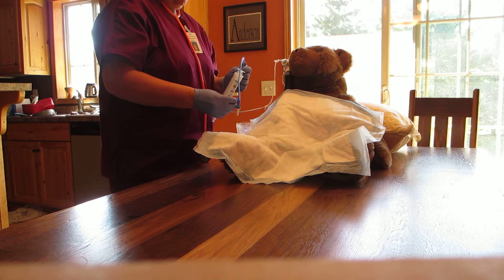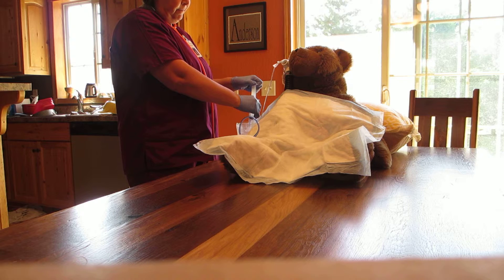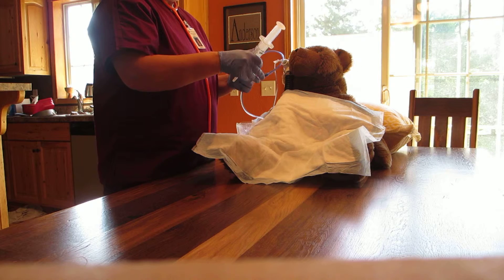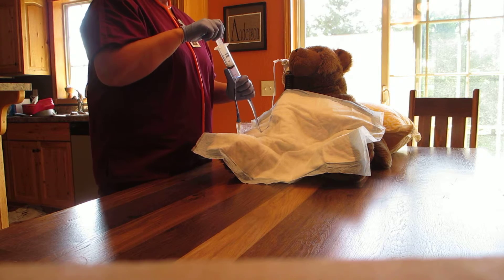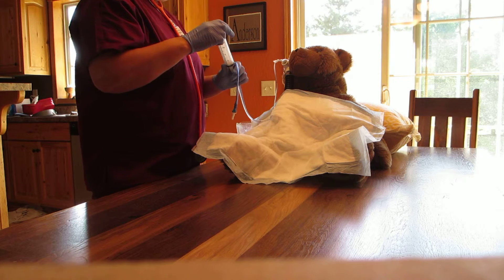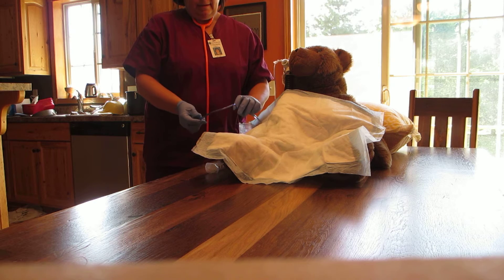I would then go and get a clean syringe and get 30 cc's of water — plain tap water is fine. I would disconnect my tubing, hold on to my tubing and my syringe, and pump back and forth trying to get that blockage to move. Once that blockage moves, my water should just go right through the tubing. I would then hook my tubing back up to the suction.